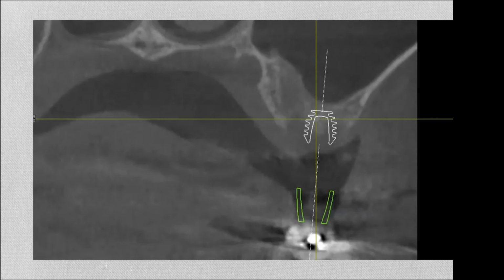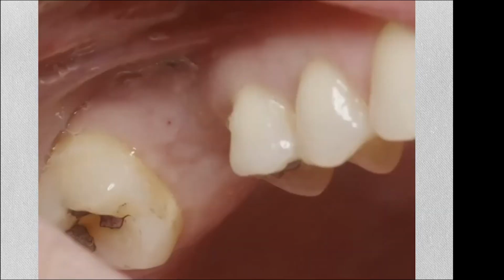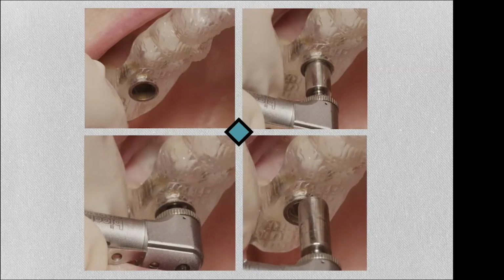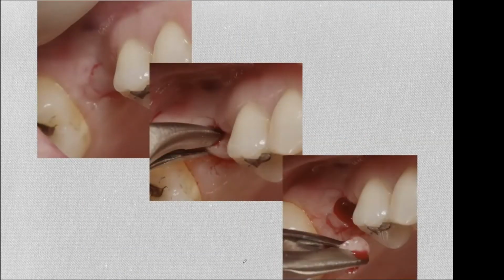We brought the patient back, and we have all of the design features, how it sat in there, etc., in the presentation. But what I just want to go through is the actual procedure itself. This is the clinical appearance, the guide in place, the punch right through the ring. So that's one step. Take the guide out, collect that little gingival plug, set it aside. That's step number 2.